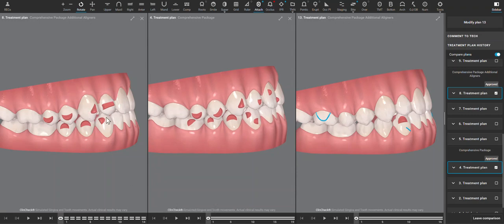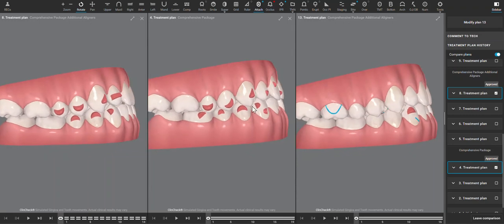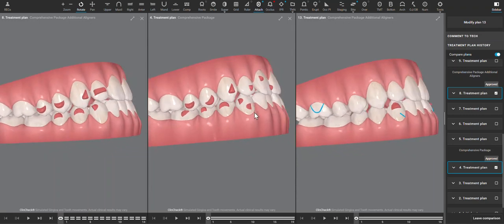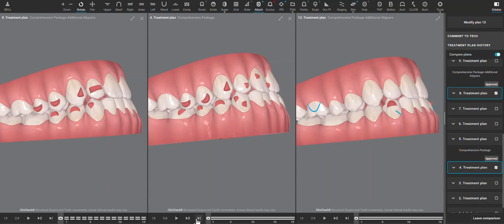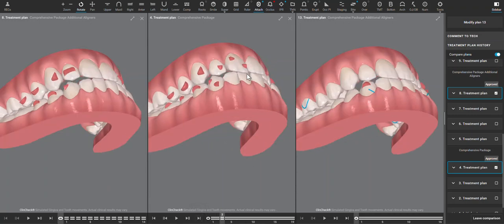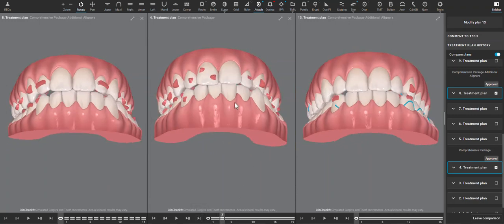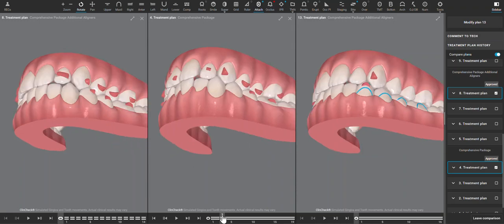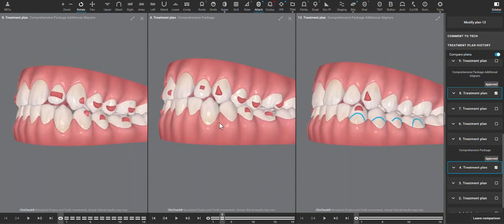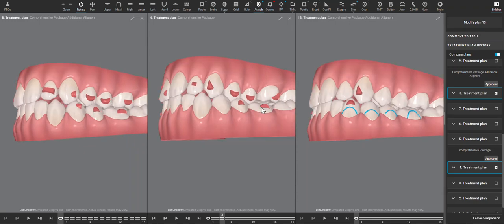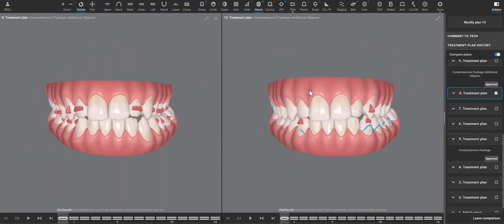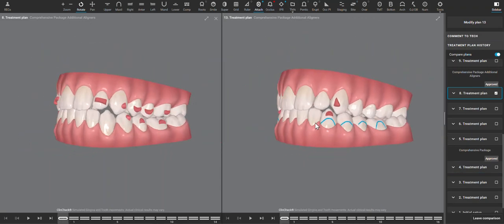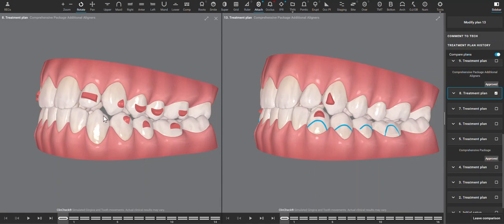And that's exactly what we found on the second round of aligners. These molar movements can tip the molars rather than move them, and without bite ramps here, which are hard to place because of the near end-to-end bite, it's very possible for the molars to passively intrude. So those could have been contributing factors to the posterior open bite.